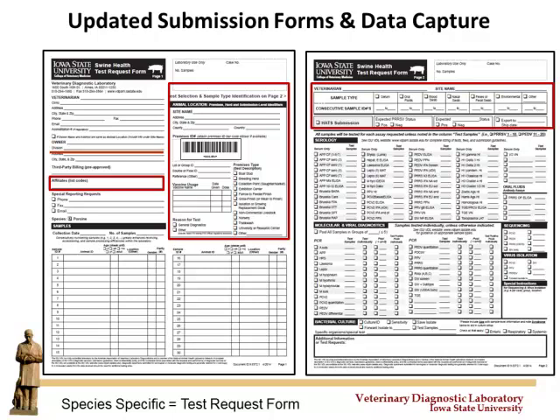And then the other thing that's really changed with the molecular diagnostics is the range of sample types we get. It's big. All kinds. It's like, you send it, we'll test it. And the challenge is that a lot of those different sample types have different techniques that have to be done to them. Does that make sense? Different extraction techniques and so on. So it's important, believe it or not, that we actually know what the sample type is. Okay? So we added the ability to do that.